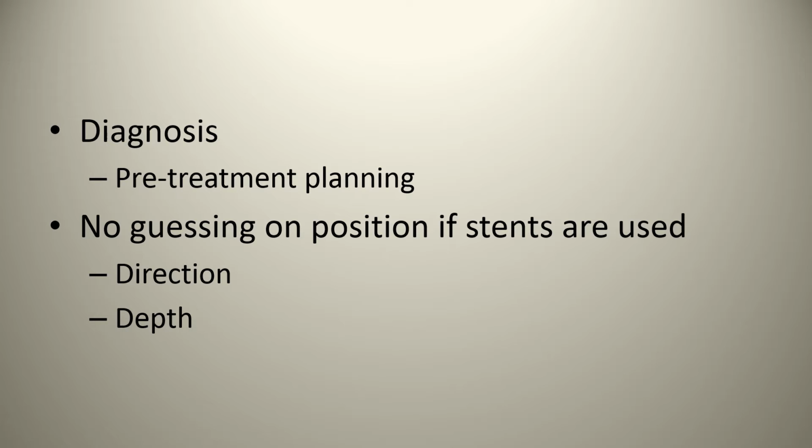There also would be basically no guessing upon position for the implant if stents are used, in terms of either direction or depth. And I may add here that when you say there's no guessing on position, remember that the ultimate gauge of placing an implant inside a patient is actually working on a patient. Even with stents, there are error factors that are introduced, and the absence of experience or skill on the part of the clinician will not be made up simply by having a cone beam CT and some sort of lab-generated stent.